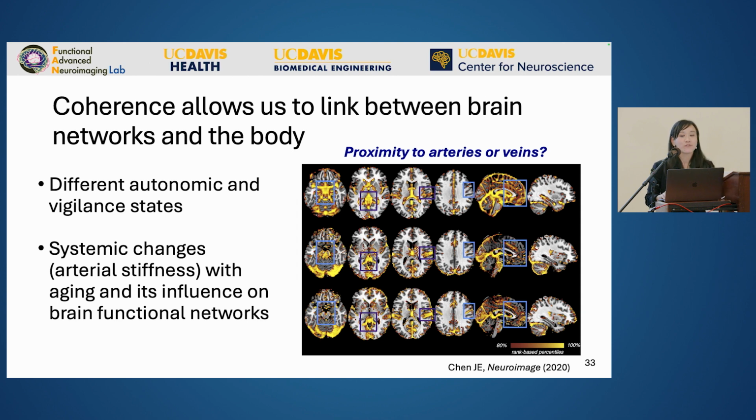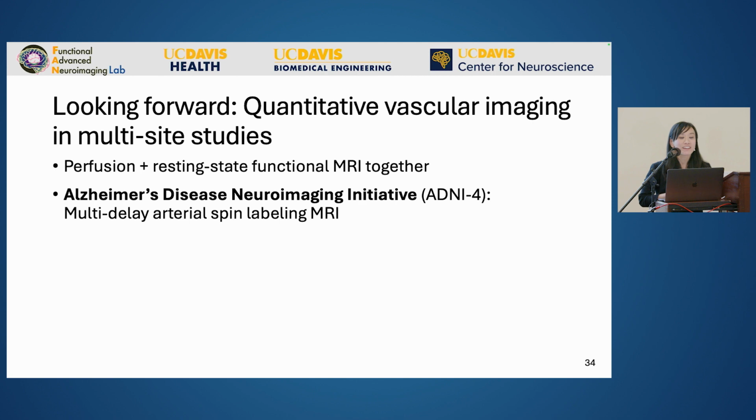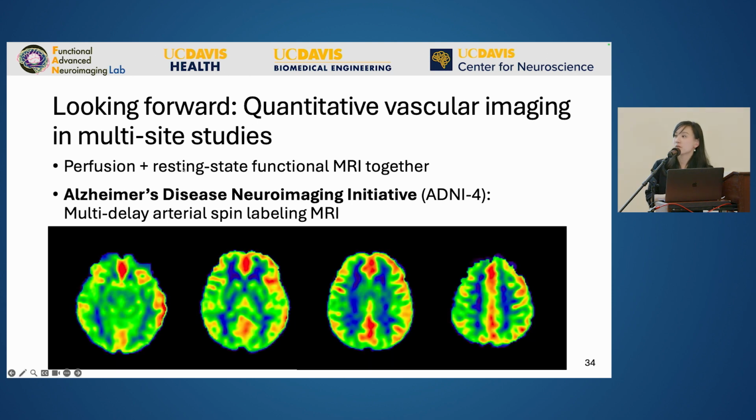So I want to end with just a few forward-looking thoughts. And one is just the tremendous potential of what I already shared, which is quantitative vascular imaging of the brain. My colleagues and I have contributed to designing a protocol to add in, for instance, perfusion imaging, so directly looking at cerebral blood flow in the brain in large multi-site studies like the Alzheimer's Disease Neuroimaging Initiative. I think we need more of these types of metrics so that we can push MRI and brain health toward a quantitative metric, just like controlling blood pressure for cardiac health. Maybe this is a way that we can learn to measure and set health targets for blood flow in the brain in the future.